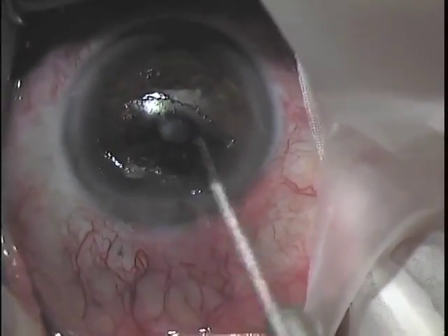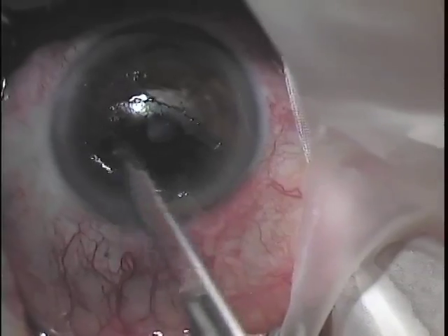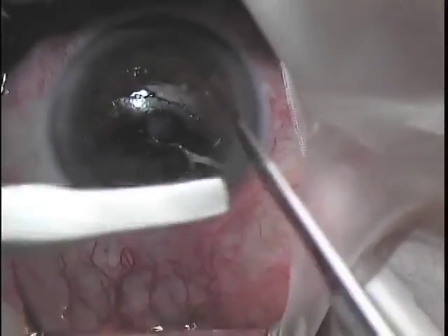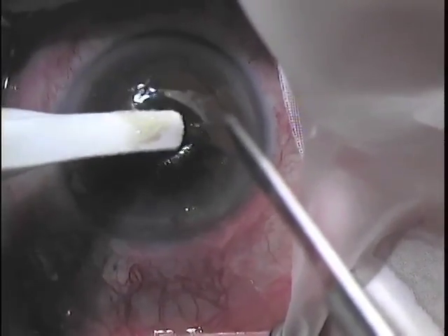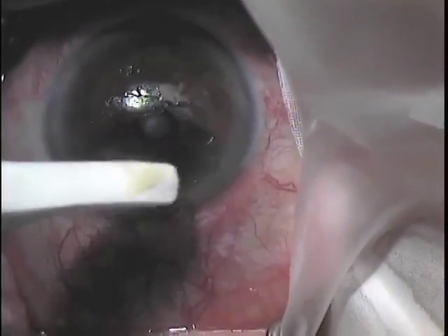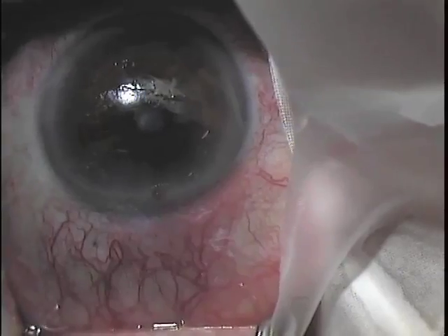We want to leave the corneal surface a little bit dry to allow the best adherence of amniotic membrane and remove all the excess epithelium. We need a defect that's at least three millimeters in size.